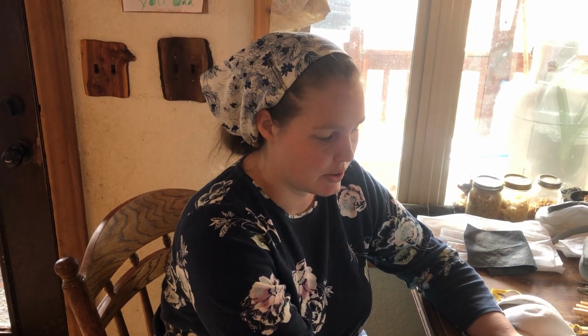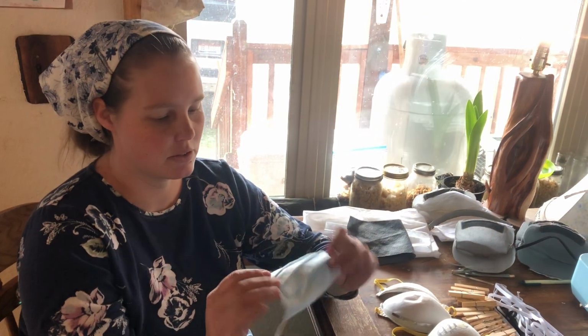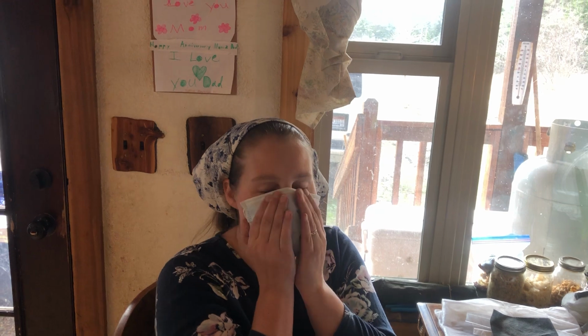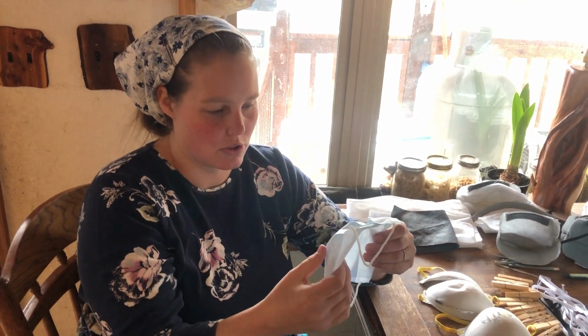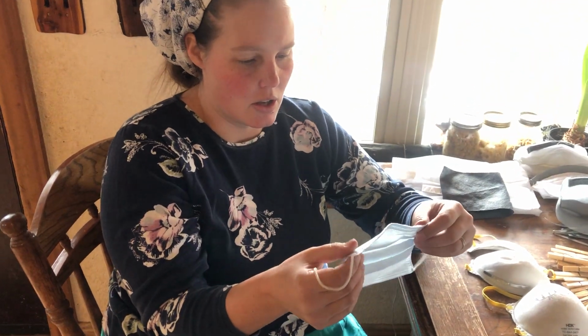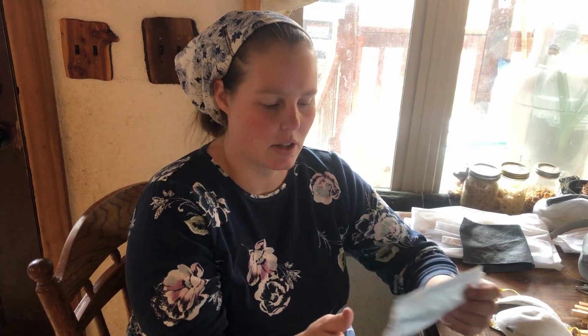And I'm looking at these people, and they've got these surgical masks on their faces, strapped as tight as they can around their faces, trying to breathe through the mask instead of around it. And this is a very nice new surgical mask that I had gotten before this whole thing started. The ones that people at the hospital were wearing were worn out. They looked like they had been reused, washed. The doctor's trying to talk to me, and the mask is sucking into his mouth, and he's having to blow it out to be able to talk. And I'm thinking, yeah, they need masks.